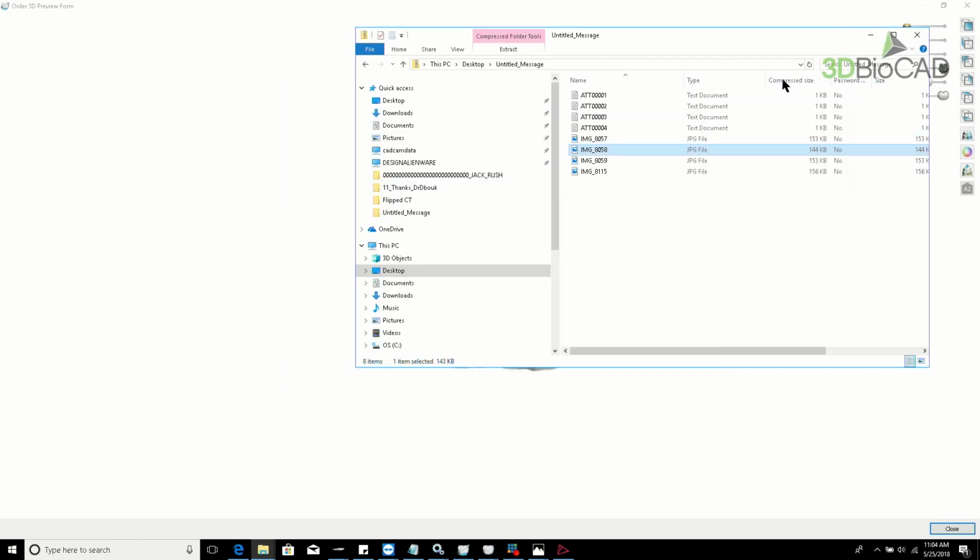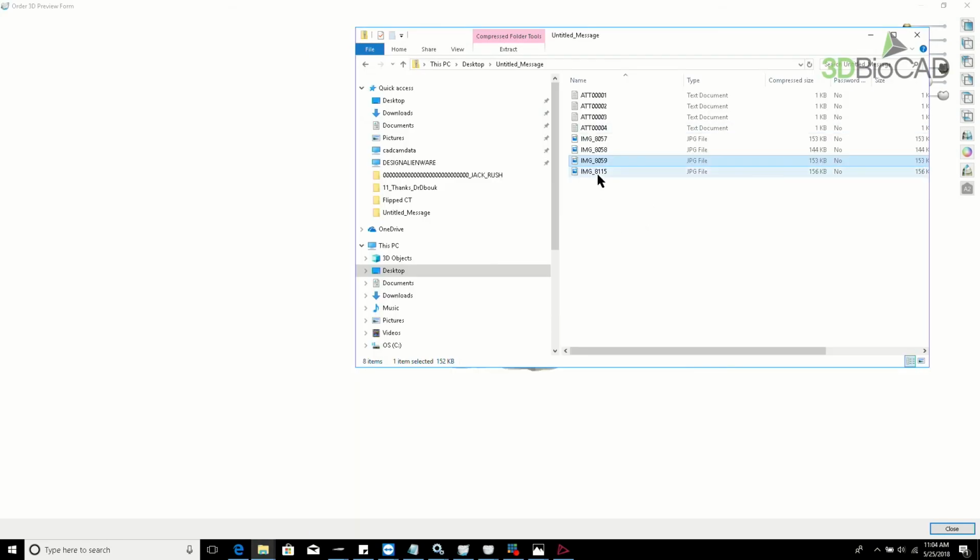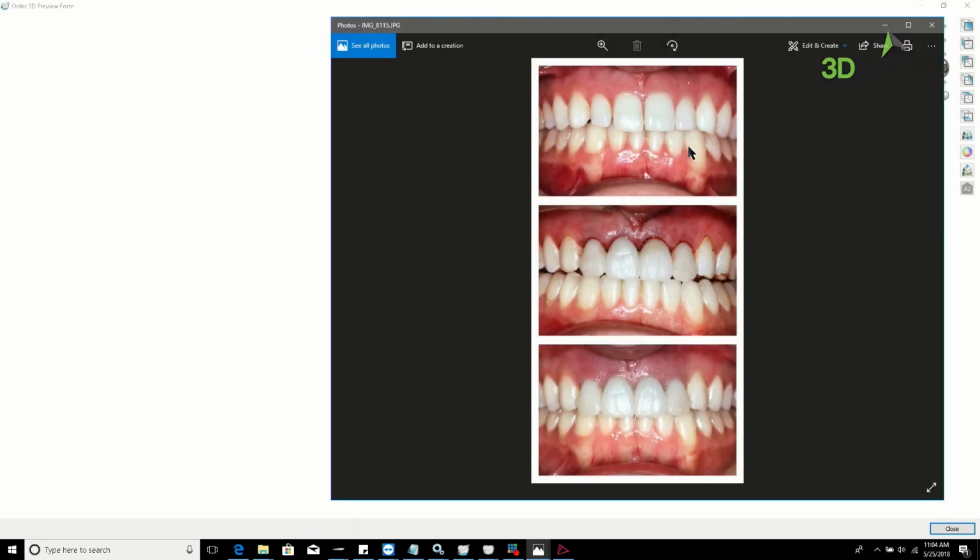After x-ray check, panorama check, and then temporary on right away. This is just right after the doctor does the relining and finishes the surgery and delivers the immediate temporary crown bridge. And then the last one, this is just before the surgery, and a second right after surgery, and then a week later check.